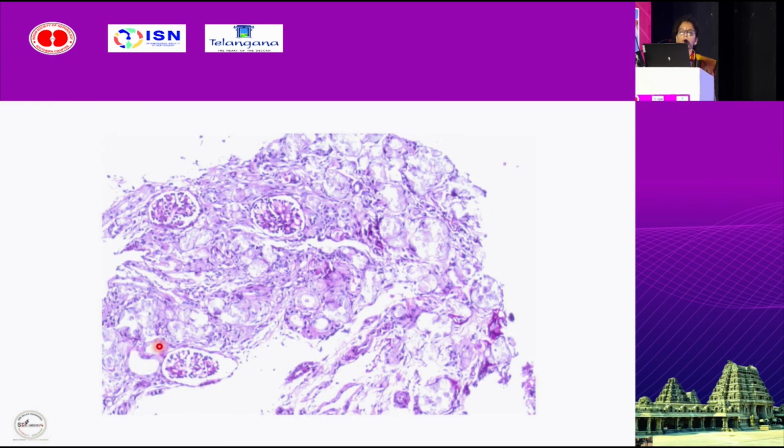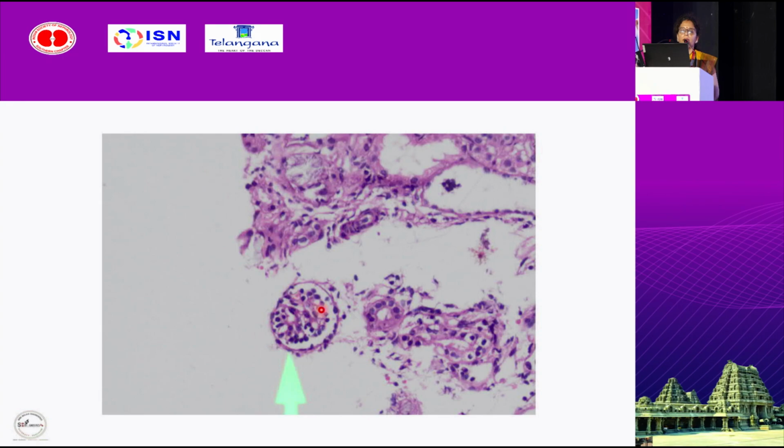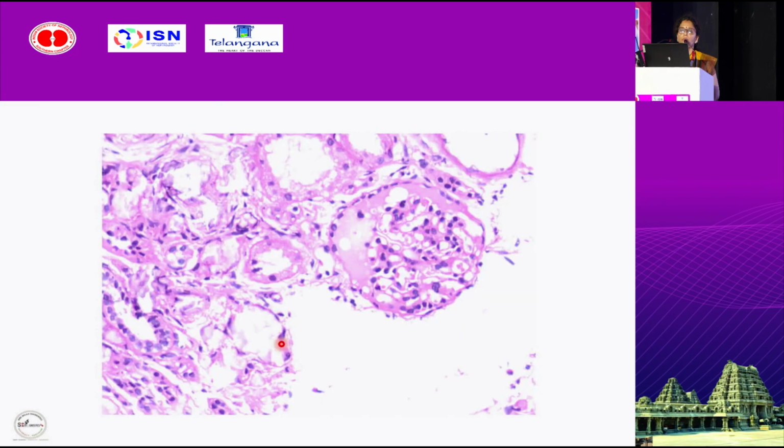So we received this core of renal cortex showing these tubules, and these were the glomeruli. Many glomeruli were of infantile type. This is the infantile type glomerulus projecting this. These are the podocytes, and very few occasional normal glomeruli were seen. There is some proteinaceous fluid here, but there is no increase in cellularity, no evidence of basement membrane thickening or duplication, or any segmental lesion like sclerosis or necrosis, and no crescents.